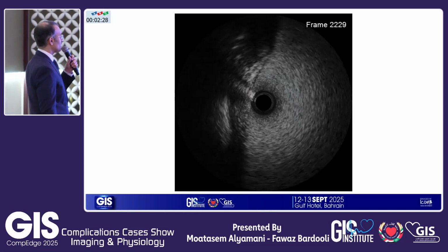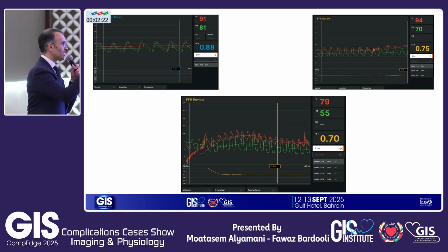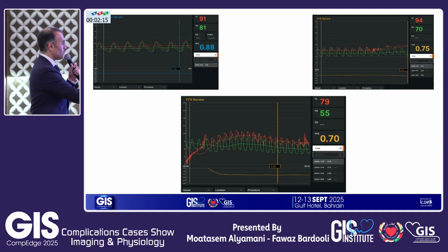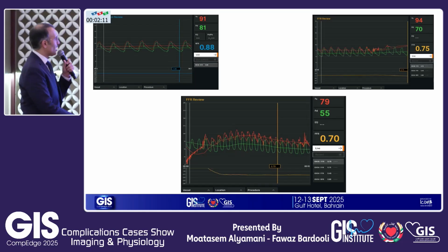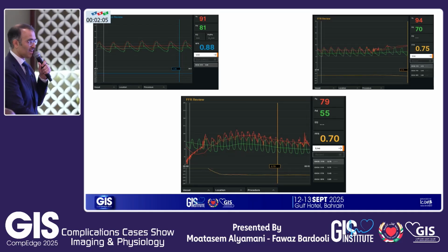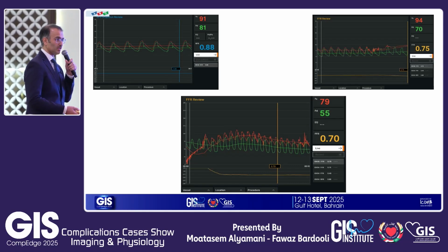Let's go to the physiology. So your RFR, and remember, we have a questionable borderline. Imagine that we haven't done the IVUS. You have a borderline left main, and you have a downstream lesion, and this is your RFR, 0.88. So it's a positive. Then you do your FFR. Your FFR is already positive. Actually, this is the baseline, and this is after the adenosine. So even you don't need to give adenosine at that time. But the question is, which one is causing the problem?